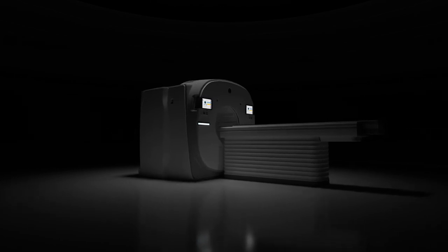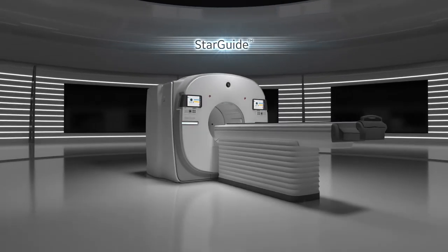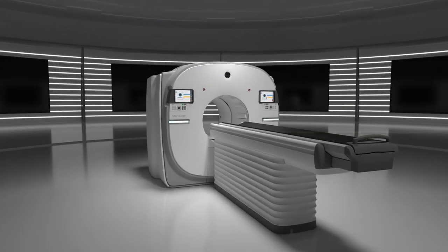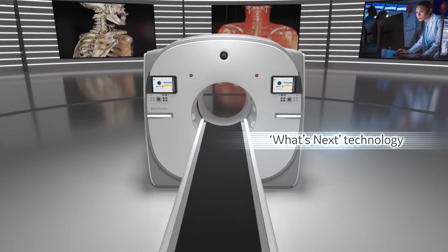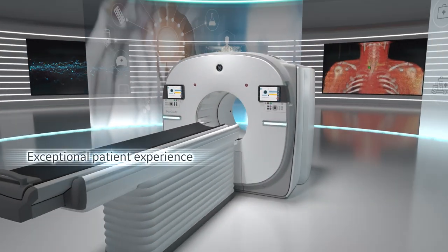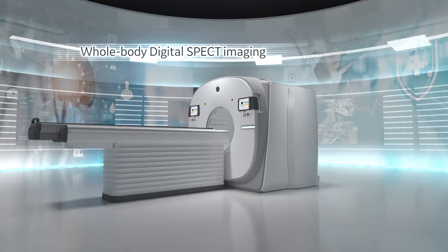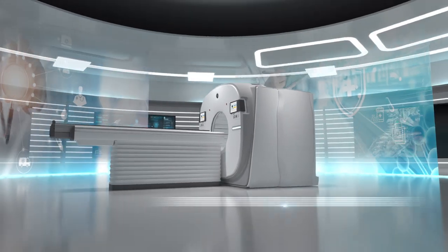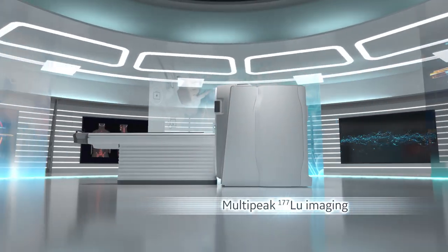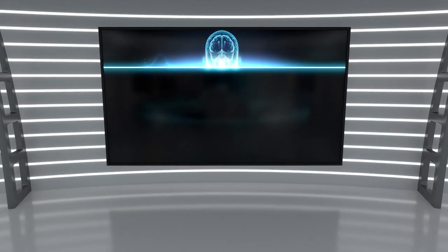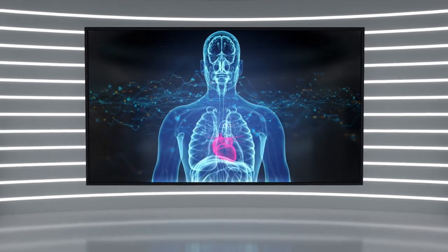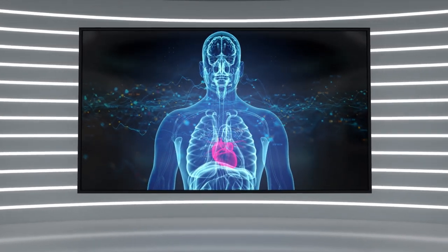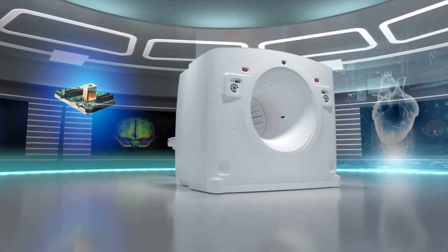Introducing StarGuide, the perfect harmony of what's next technology and exceptional patient experience. Whole-body digital-specced imaging, multi-peak lutetium-177 imaging, providing clear data to detect, locate and quantify conditions early and accurately.